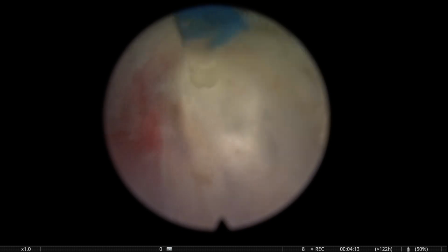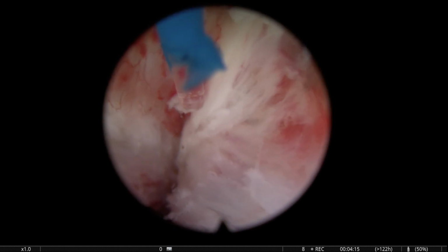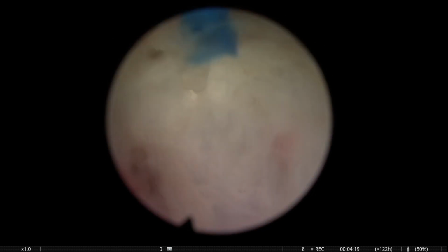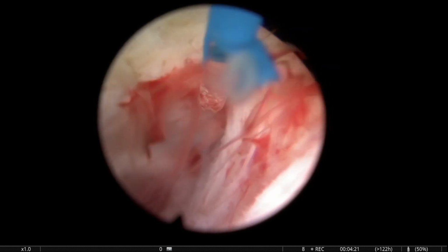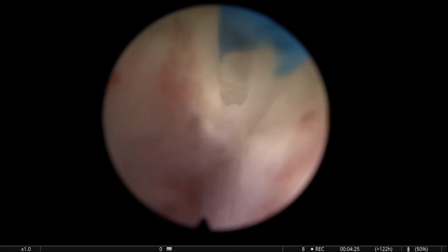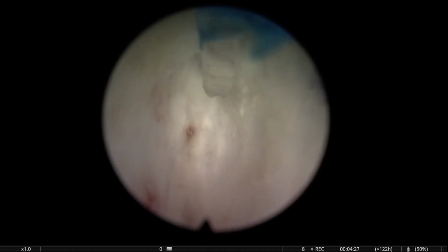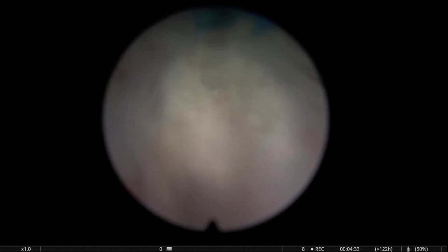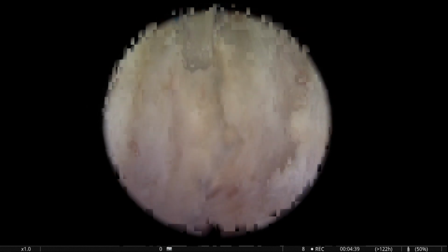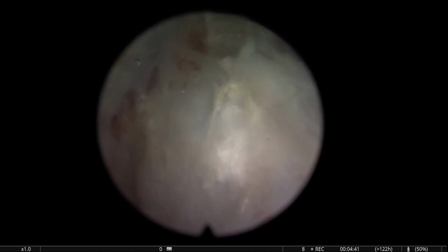So we have to start thinking, and I think the mentality is probably less frustrating, that we need to look for a capsular plane. And a capsular plane is a plane that looks fibrous, that looks relatively smooth, that is mainly white in color, because the adenomatous component is usually a little bit more yellow than the proper capsule.